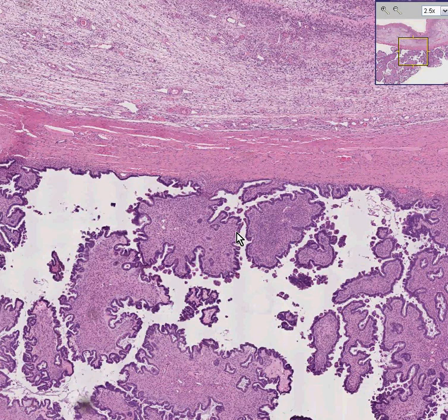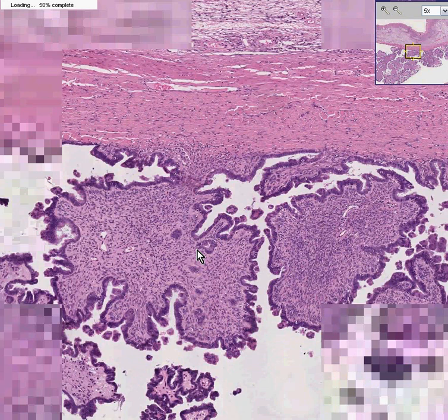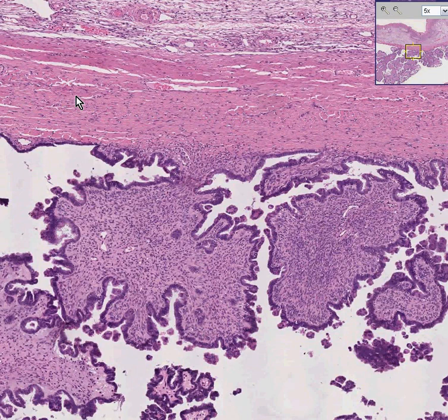It could be called a cystadenoma if we were 100% sure it was benign, or a cystadenocarcinoma if we were 100% sure it's malignant. What if we're not 100% sure, even after we all look at it and we're still not sure? The nice feature making this look benign is that the capsule, or the wall of the cyst, is not invaded at all.